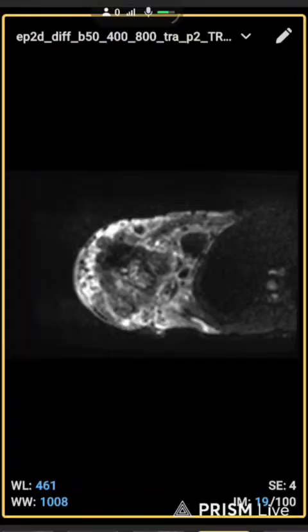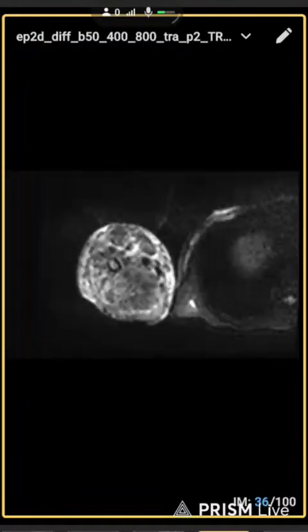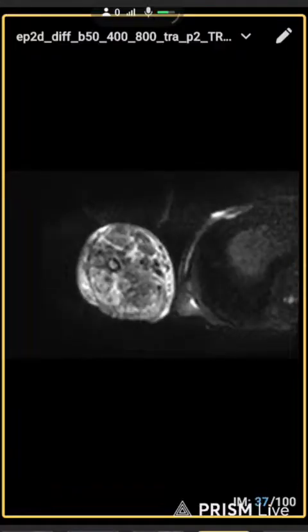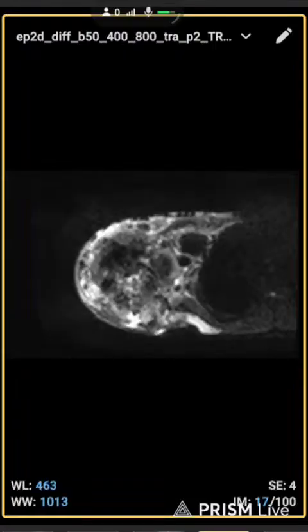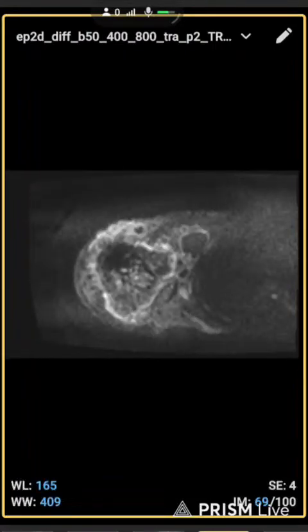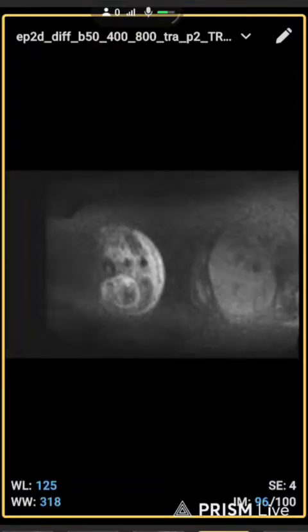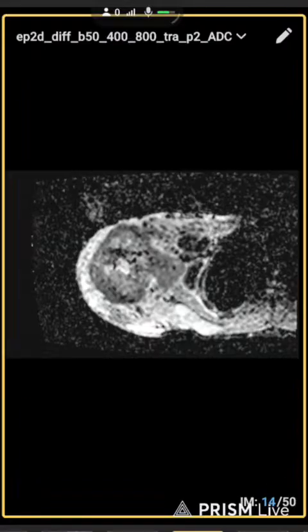We can sense according to the FOV, with some other things we have to increase, because in MR you don't change the FOV for every sequence.